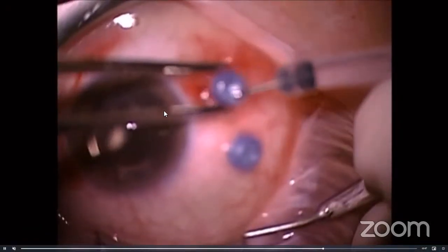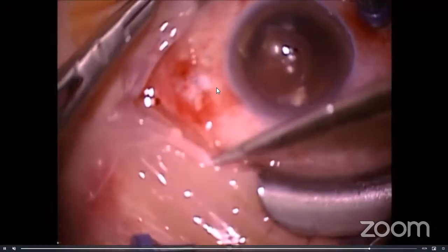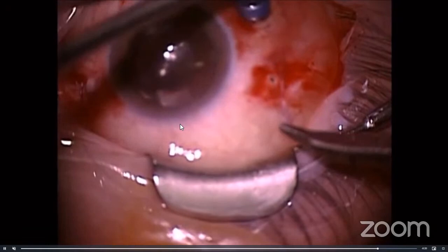In this case, he changed the infusion to a larger bore for the direct silicone oil exchange. When he injects the silicone oil, the heavy liquid here is being removed. Of course, prior to this, we must ensure the rim of the fluid is completely removed before we inject the silicone oil.